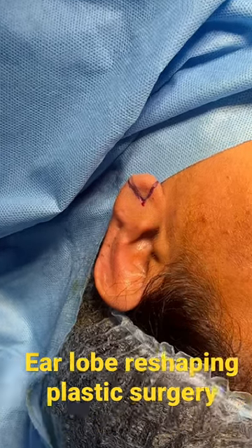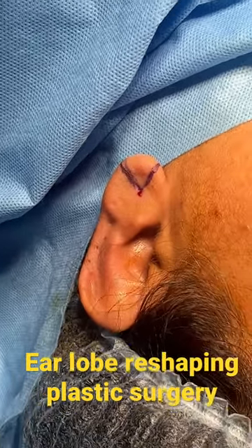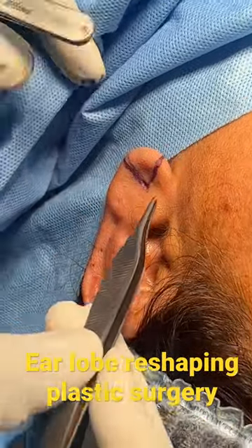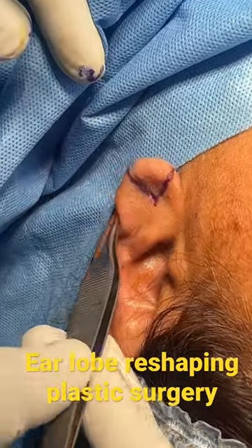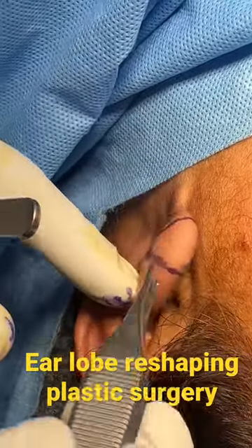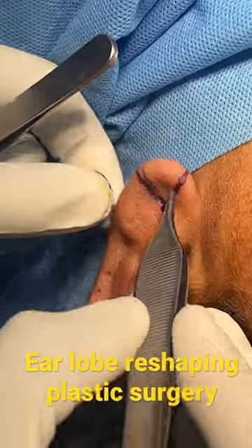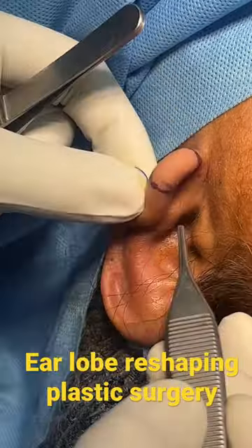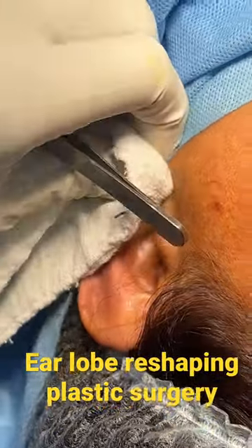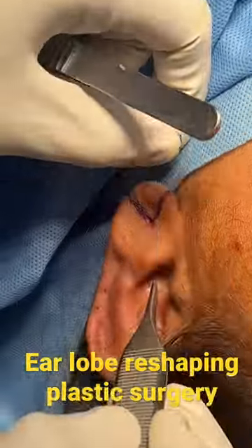We're going to do an earlobe repair here — it's almost a reshaping of the earlobe. You can see this earlobe is pretty big for the proportion of the ear. We've marked out what's going to be like a pizza piece excision, and then we're going to be closing it.